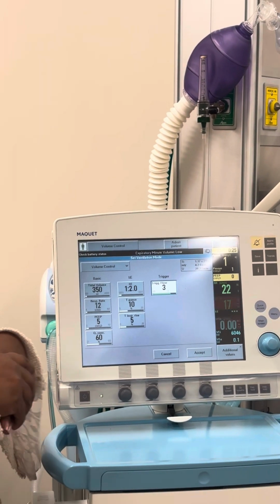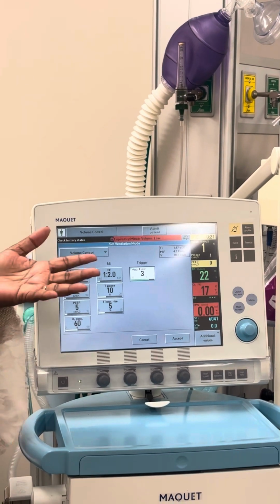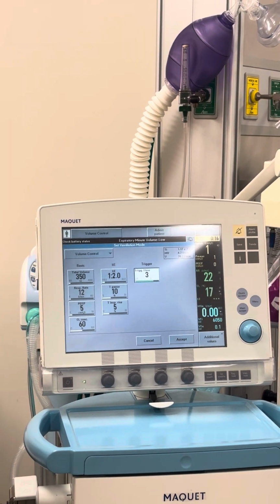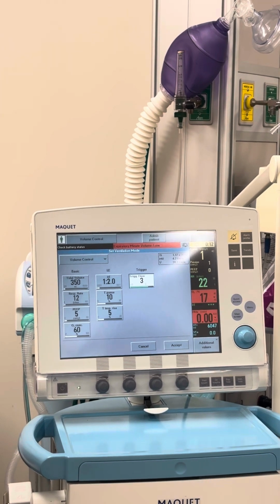I was going to say not square. Yeah, square, and then decelerating. But it is gradual. I'll take that. That's still gradual, but decelerating ramp. And then what did I say, flow rate? 40 to 60. All right, you set it probably around 50 to start.